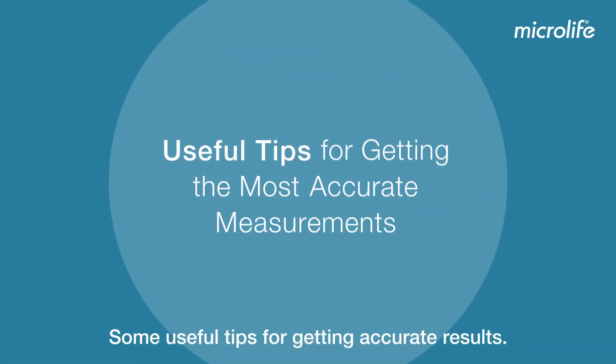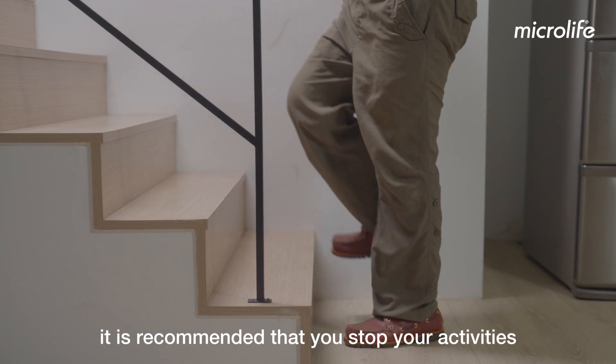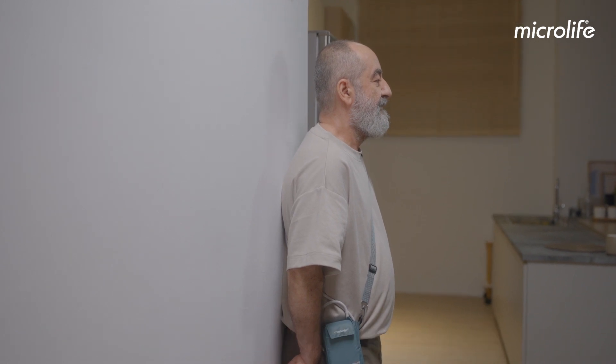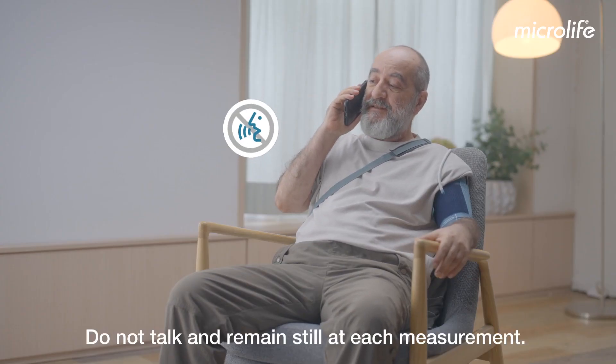Useful tips for getting accurate results: once the measurement starts, it is recommended that you stop your activities as soon as possible and keep your arms still. Do not talk and remain still at each measurement.